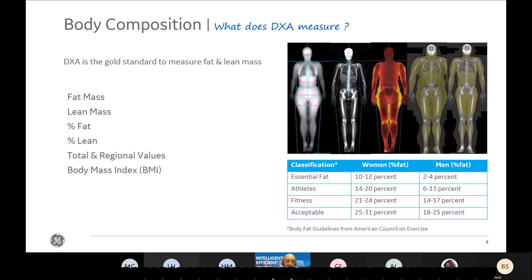As you can see on the right, we deliver also in the reports in the software the total body image. But you can also work in the different regions of interest of the full body — the arms, the legs, the trunk. And you can also have a color coding map showing the level of adiposity, for example in yellow, and the level of lean mass in red.